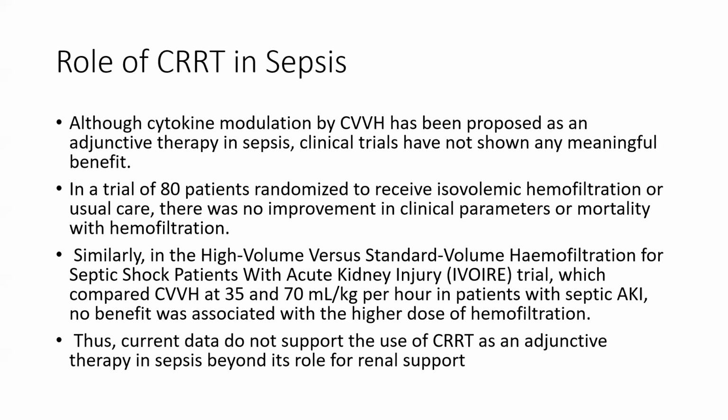Now, the next is the role of CRRT in sepsis. Although cytokine modulation by CVVH is proposed as an adjunctive therapy in sepsis, clinical trials have not shown any meaningful benefit. In a trial of 80 patients randomized to receive isovolumic hemofiltration or usual care, there was no improvement in the clinical parameters or mortality with hemofiltration.